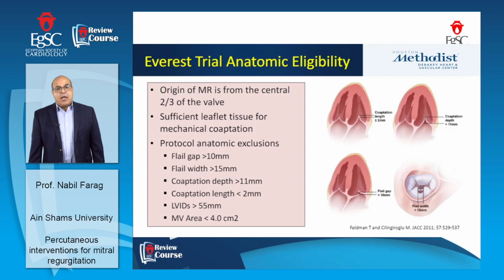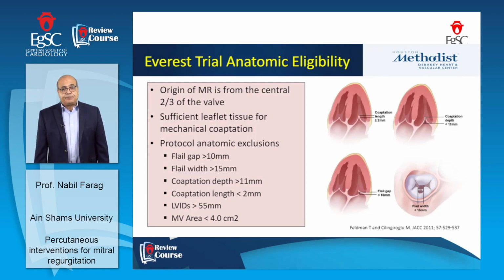All of these criteria are considered favorable for the MitraClip. Again, all of these anatomical eligibility criteria were taken from the EVEREST trial. Again, very important, no mitral stenosis, no or minimal calcification.